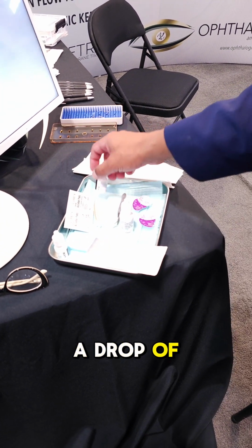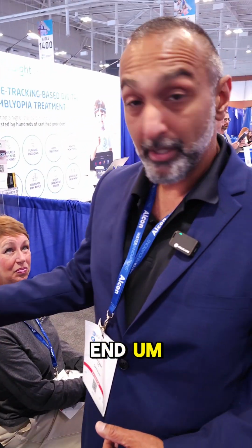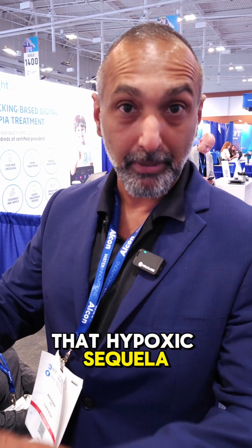We also have a drop of Maxitrol, which I'll show you for demonstration purposes where that fits in at the end. But we do, Maxitrol drops, not ointment. We do oftentimes give a combination antibiotic steroid drop as part of the post-procedural regimen for that few days of treatment. Why? Because when you sleep with a contact lens, your two most common concerns are hypoxia and infection. The dexamethasone component will very safely and effectively keep that hypoxic sequelae at bay. Things like corneal infiltration, ulceration, anterior chamber reaction, corneal edema, all that stuff will be nicely at bay for a few days very safely with the dexamethasone component.